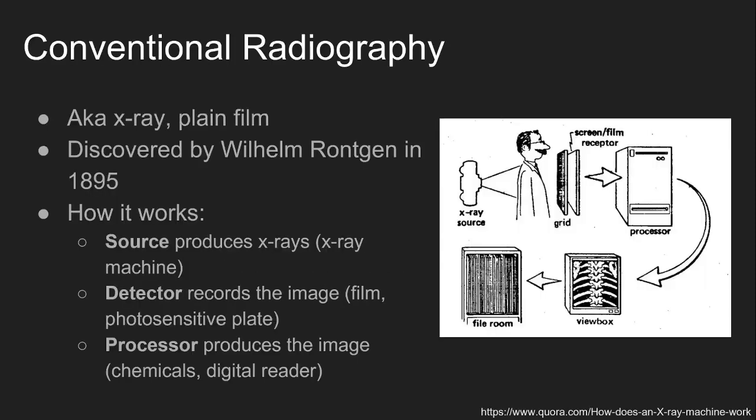So let's get started. The oldest and most commonly used imaging modality is the conventional radiograph, also known as an X-ray or plain film. The X-ray was incidentally discovered by Wilhelm Röntgen in 1895. He later went on to win the Nobel Prize in Physics for the discovery in 1901.